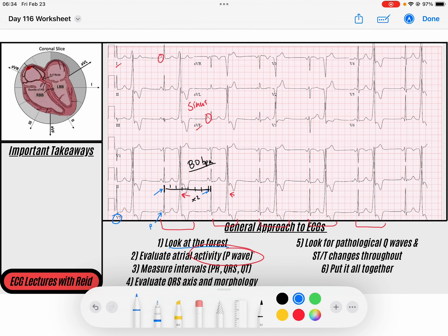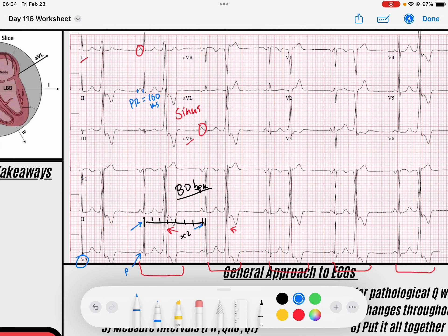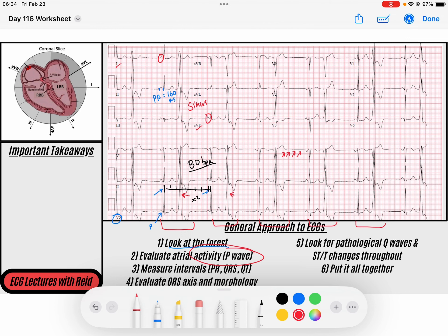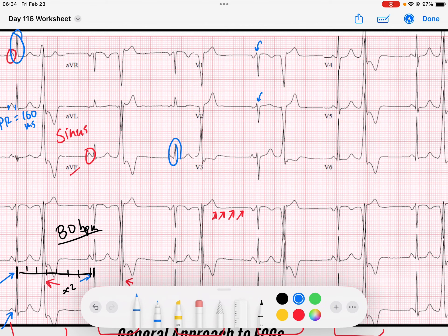Let's look at AV node function. The PR interval looks like about 160 milliseconds — maybe four small boxes — so it's normal. Every P wave I see conducts to a QRS in the same fashion, and I don't see any P waves throughout the pauses that are not being conducted. The QRS is upright in lead one and upright in AVF, telling me the axis of depolarization is down to the left, which is good. R wave progression looks good, possibly a little late at V3 but we get a good upright R in V4 — likely just lead placement.